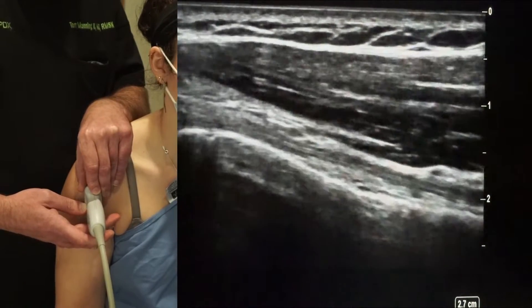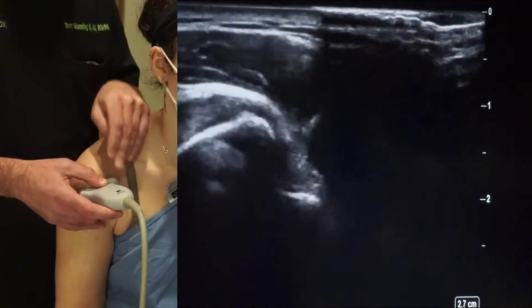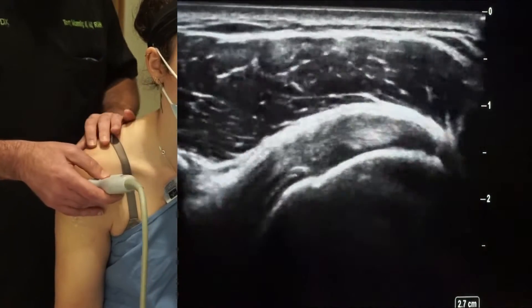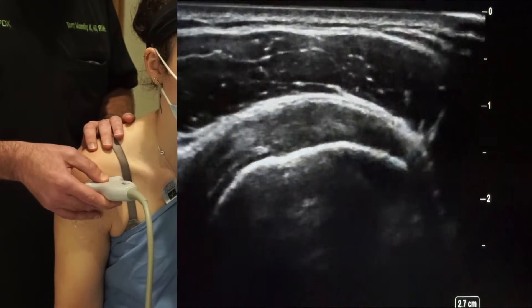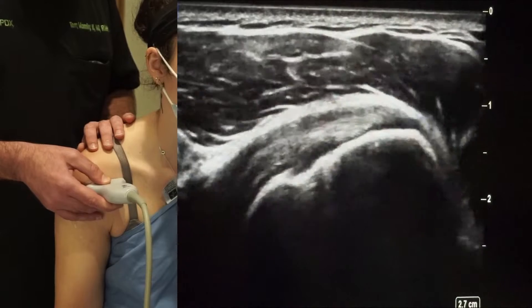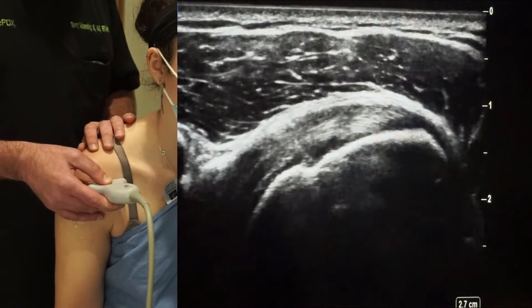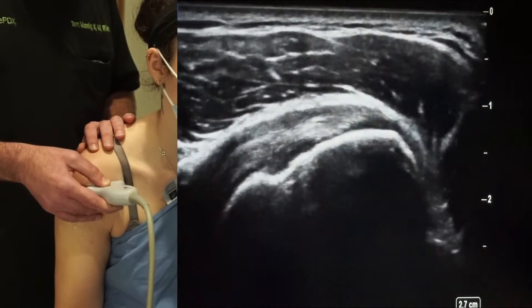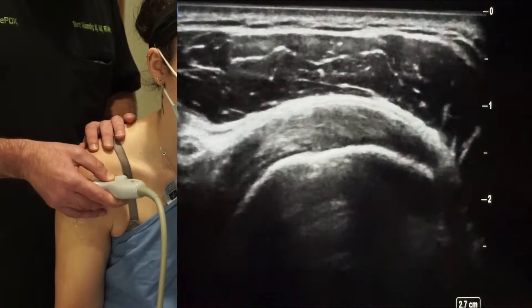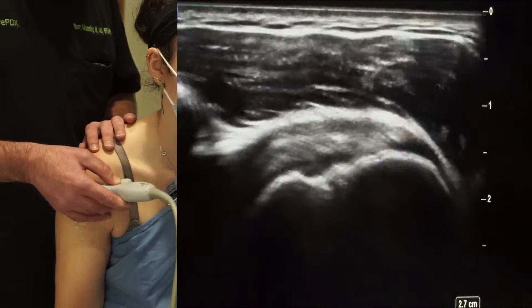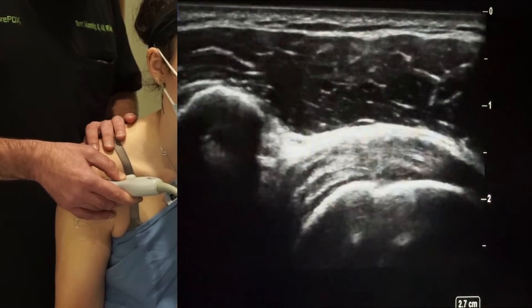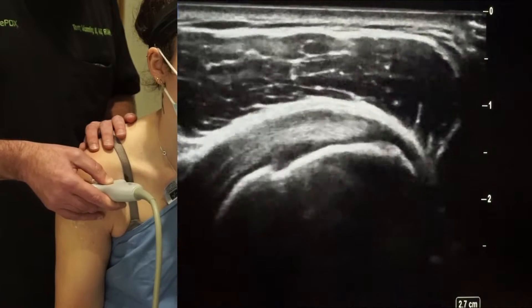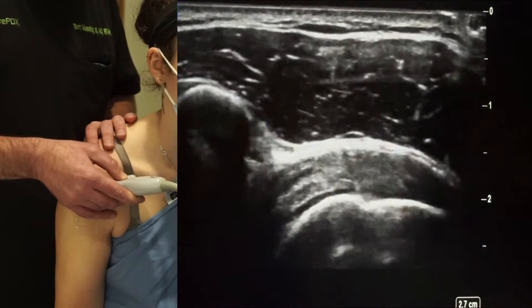That's a nice healthy looking long head of the biceps tendon. Since we're anterior, we'll rotate the shoulder just a little bit and now we are on the subscapularis tendon. Our bony landmarks for this structure are the lesser tubercle of the humeral head, where the tendon inserts, and medially, the coracoid process of the scapula. We're scanning the width and breadth of the subscapularis insertion and the tendon itself. Towards the coracoid process, we see some hypoechoic changes — that's actually the muscle belly as the myotendinous junction comes into the tendon. That's not a tear; that's just what normal muscle looks like.